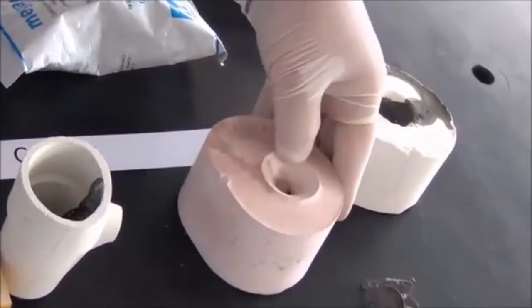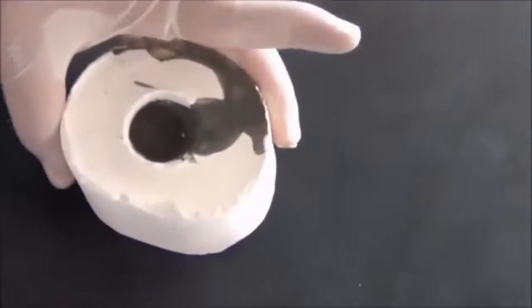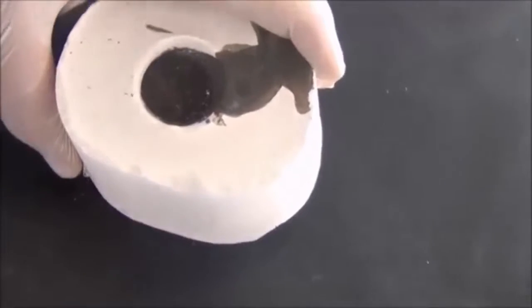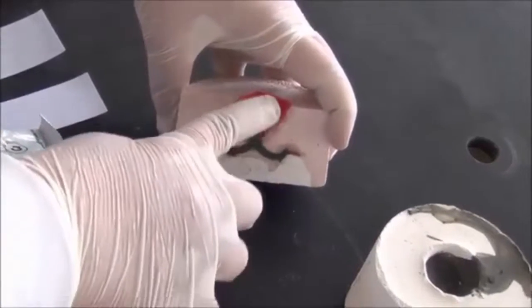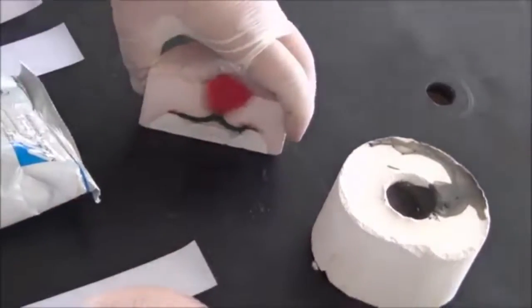So after pouring the metal, it's taken out of the casting machine and left to cool. And what I get now is metal inside this investment ring. So if I take the cross section of this, it will be this exact shape, but all of these are now replaced by metal. These are all in metal.